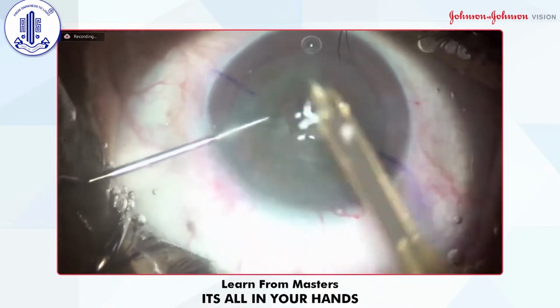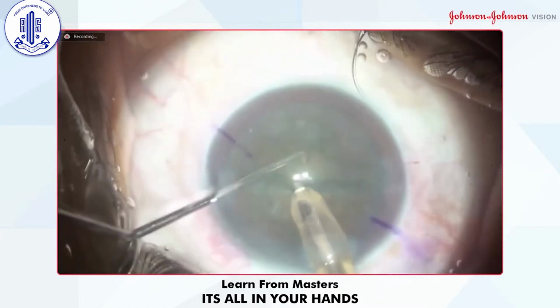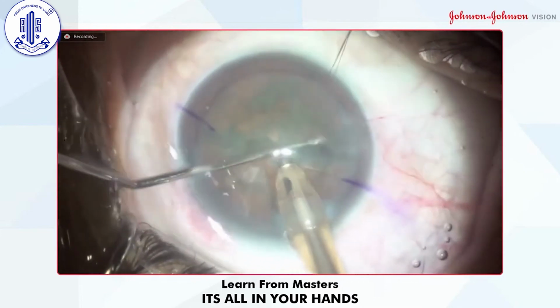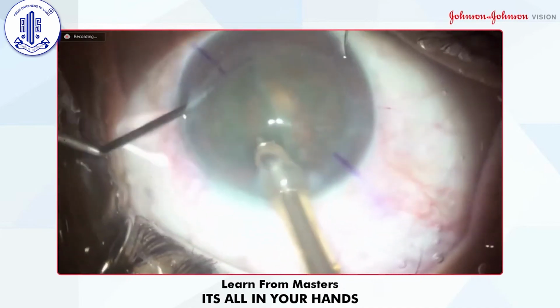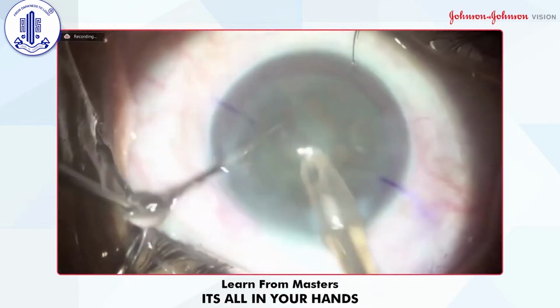So you are seeing that I have cracked the nucleus by a specially designed chopper, and I just directly jump to the Phaco 2. This is a confirmative step that the two pieces I made are completely separated out.